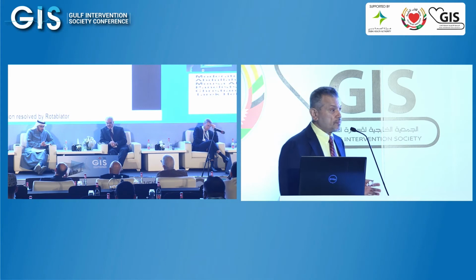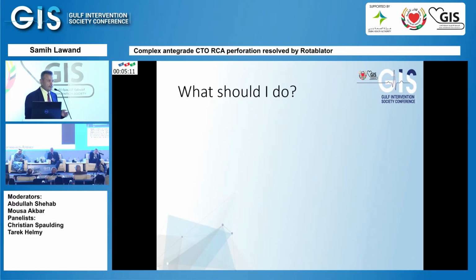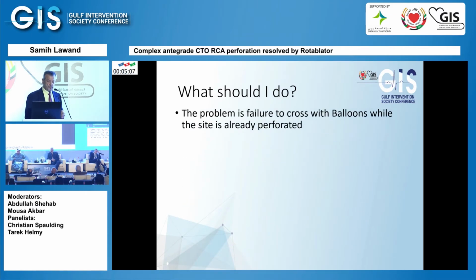So what should I do? If you want to help me here, I can entertain with you what should we do. The question is, this is a failure to cross with balloons from the smallest to the middle-sized, and already there is a perforation at the site.